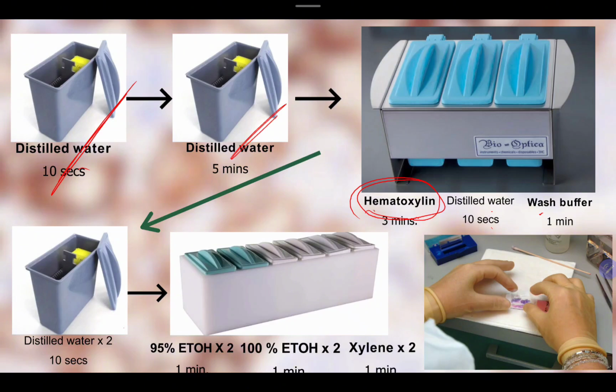The procedure is long, and usually if you make even one mistake, it's risky. Reminding everyone again that IHC procedures are quite expensive because you pay per stain. Sometimes a single stain costs a minimum of 3,000 pesos. So for a breast panel, ER, PR, HER2, that's already 3 stains, so more or less 9,000 pesos. And if you, the medtech, make a mistake, it's such a waste. Plus, the procedure takes a long time.